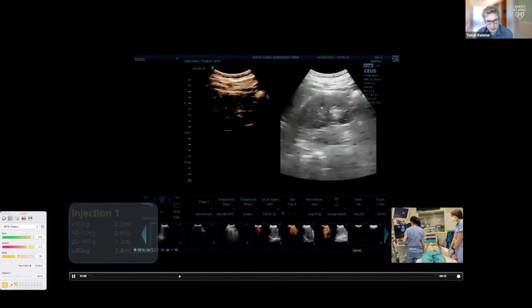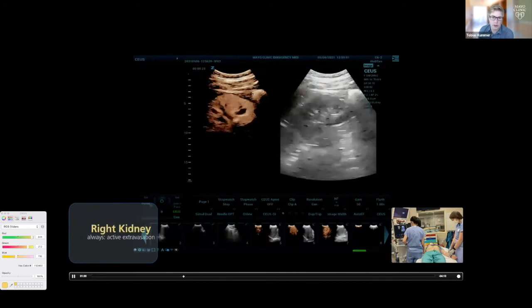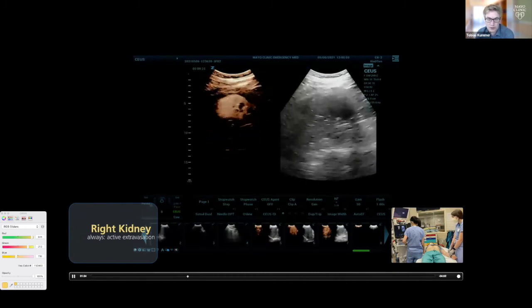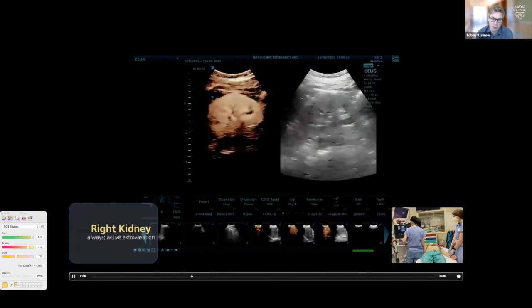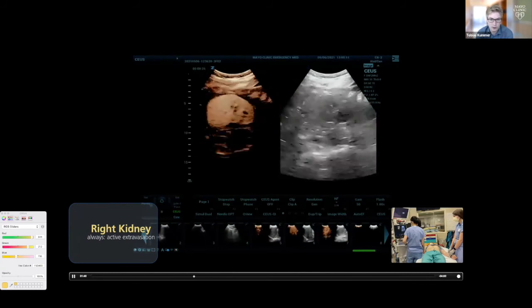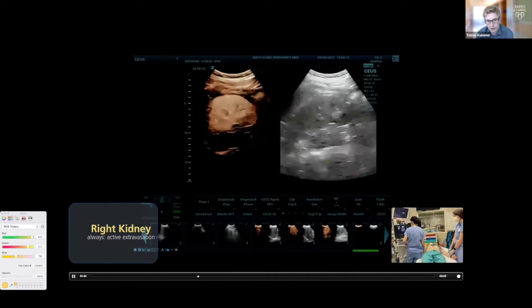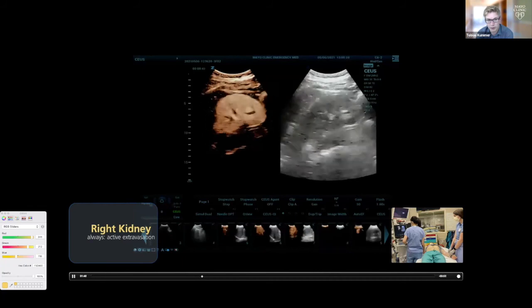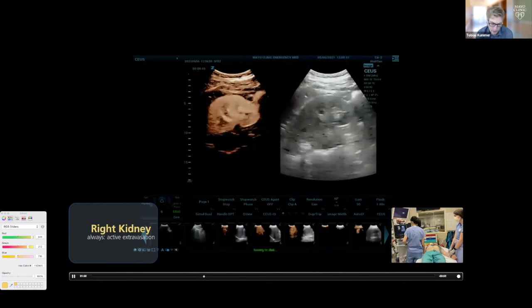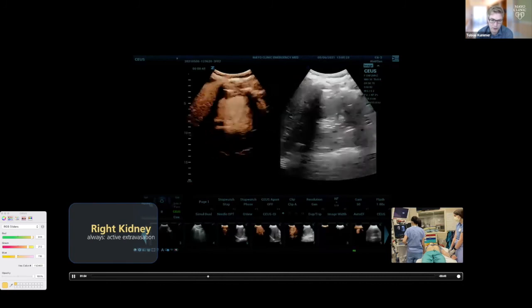So we look at the kidney first. And here's where it looks a little bit washed out, like I said earlier. It's usually not as dramatic. You should still see single bubbles. Then in a sagittal plane, we fan anterior and posterior. In any of these views, you want to look for active extravasation. Are there any bubbles outside of the organ swimming in the free fluid, which hypothetically would mean the patient is at higher risk to deteriorate if they're still bleeding.